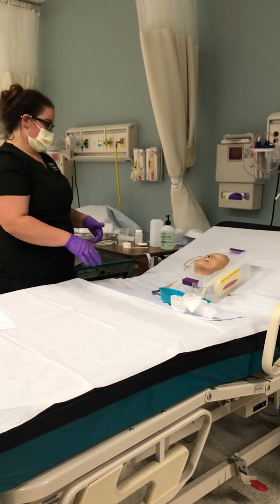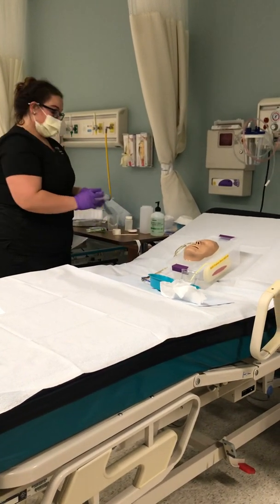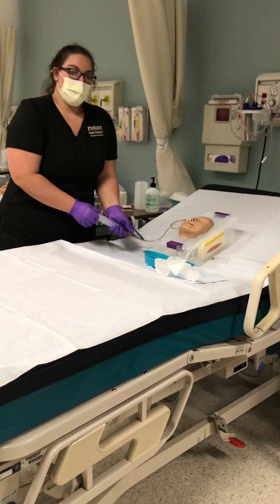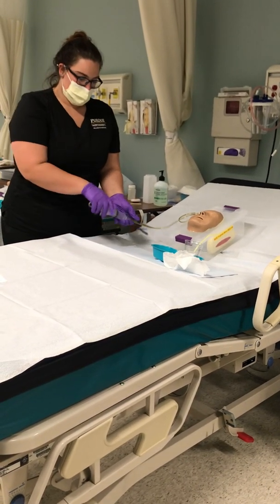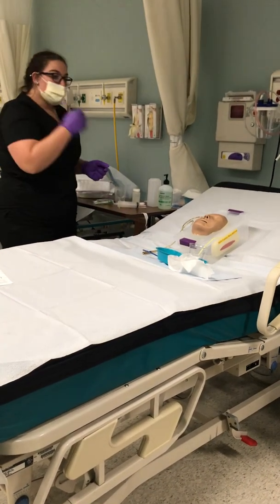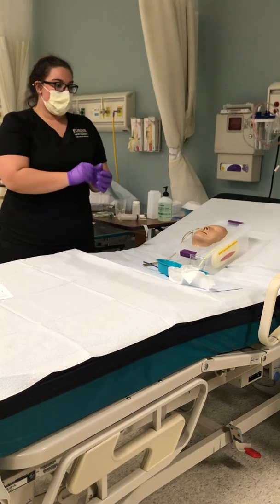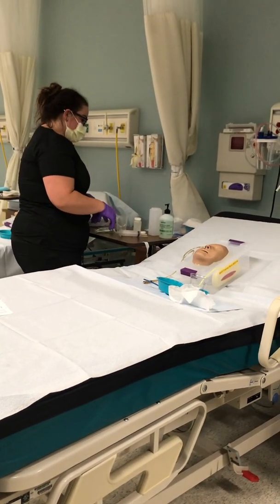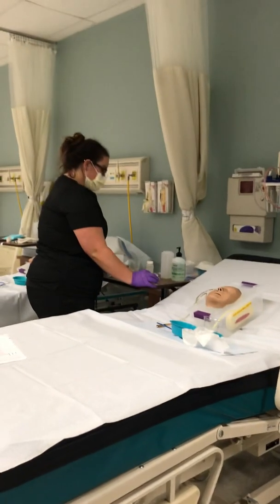And then you will grab your syringe. You can check the pH to see if the stomach contents seem normal. Take those out. You would clamp it to take the syringe off. Use a pH strip to test, or you could have an x-ray to have it tested. And then once you're sure that you have it in the proper location, you will go ahead and secure it.